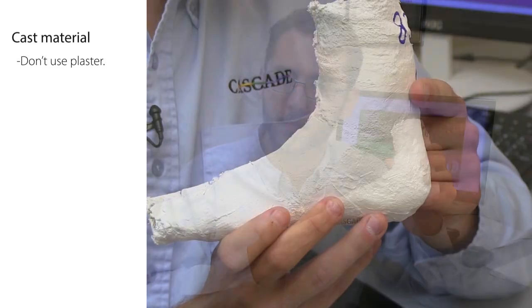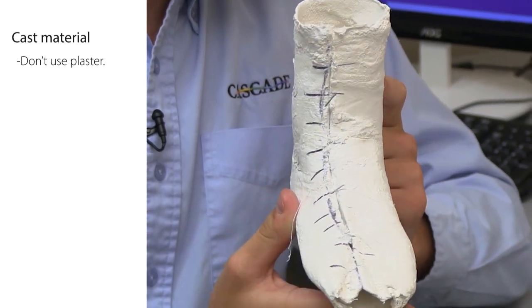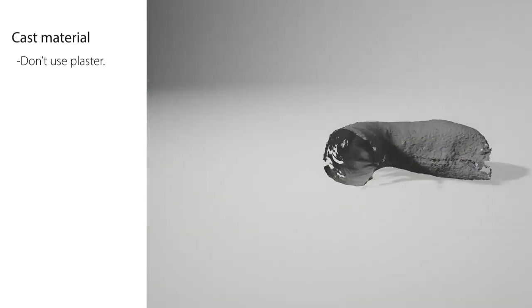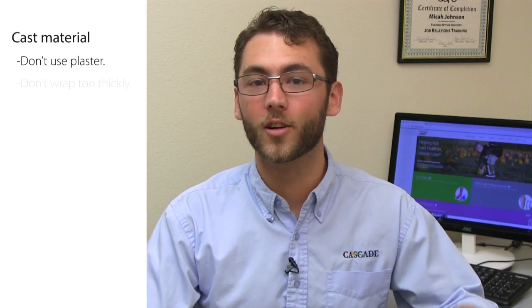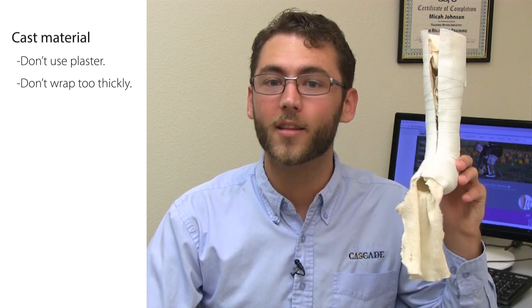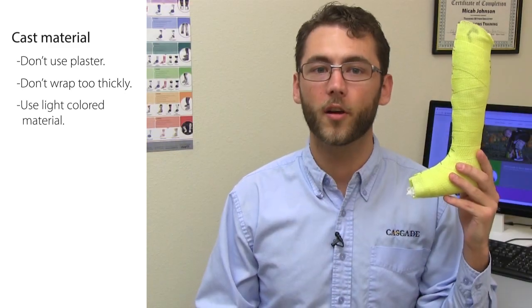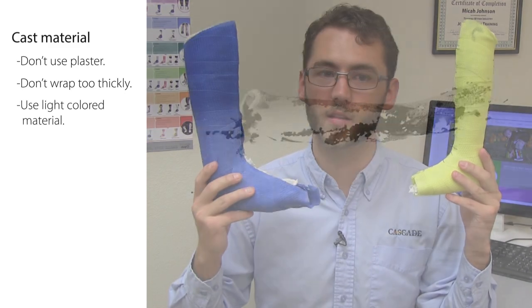When creating a cast that will be scanned, here are some particulars to keep in mind. Casting material: don't use plaster. While plaster casts capture the anatomy really well inside the cast, it's too uneven on the outside and an accurate shape won't get picked up in the scan. Any type of fiberglass tape is preferred. Regardless of material, don't wrap too thickly — this can make it hard to measure cast thickness and mask anatomy. Light colored material is best for all scanners because dark material like dark blue or black doesn't scan well.